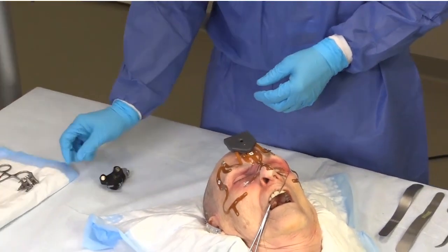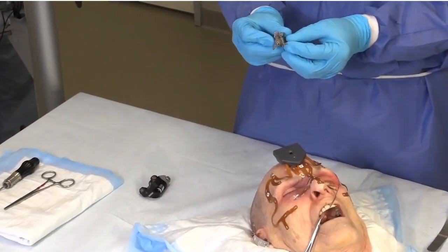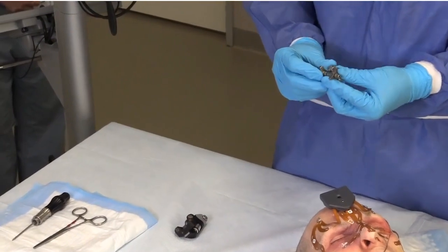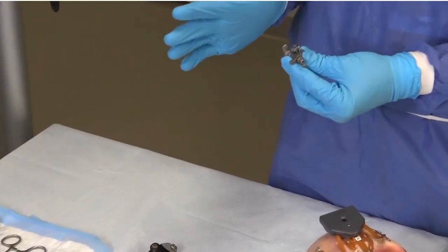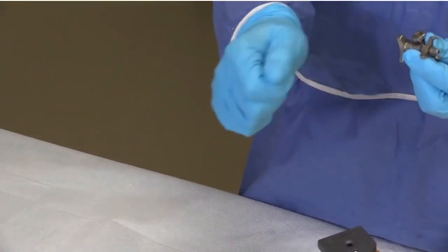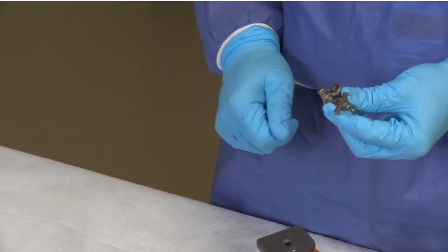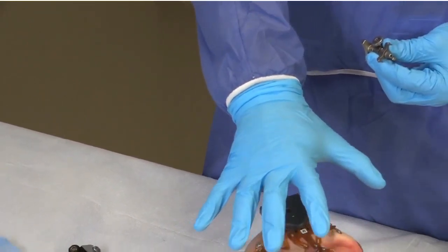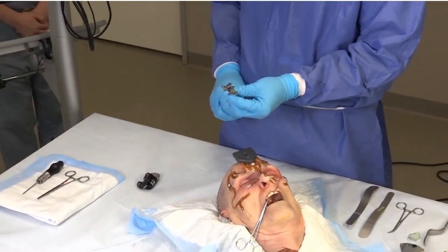The skull post, which I have here, looks a lot like the lunar lander. It will be fixed to the skull bone and act for tracking — tracking your movements through the skeleton as you're working. You can still use the mask for registration, then use the skull post for tracking.